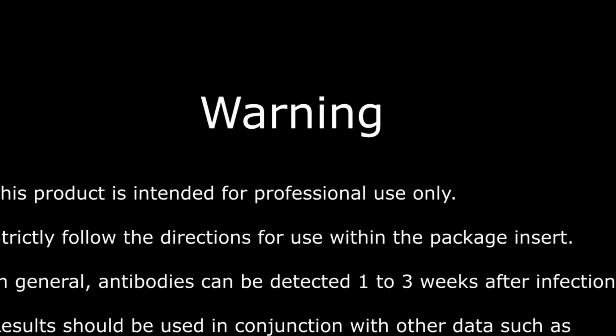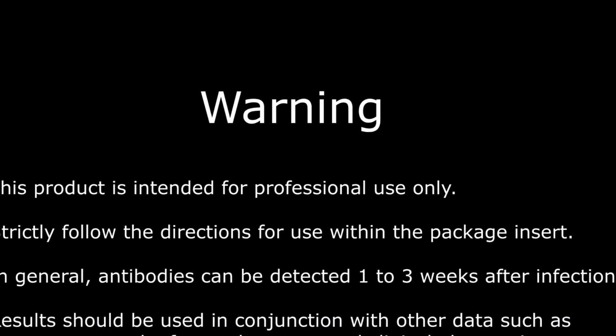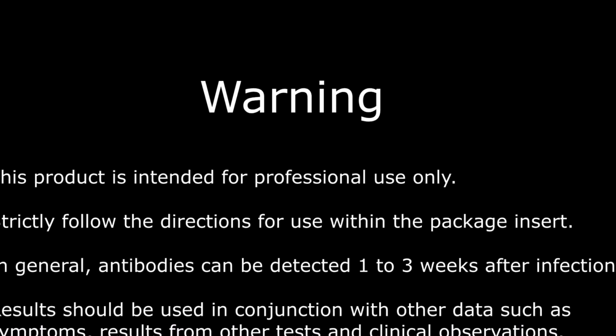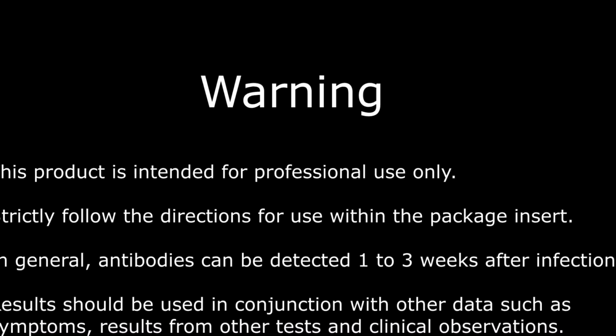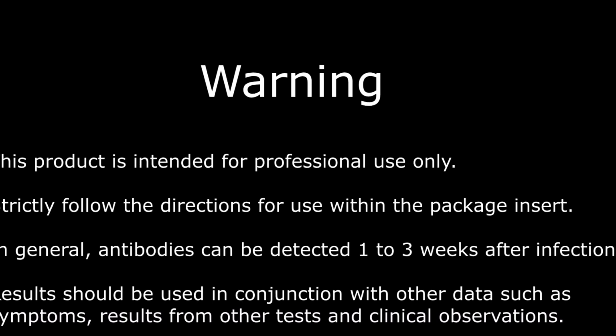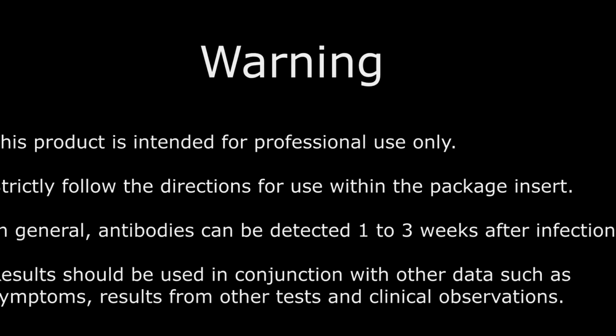Warning: this product is intended for professional use only. Strictly follow the directions for use within the package insert. In general, antibodies can be detected 1 to 3 weeks after infection. Results should be used in conjunction with other data such as symptoms, results from other tests, and clinical observations.